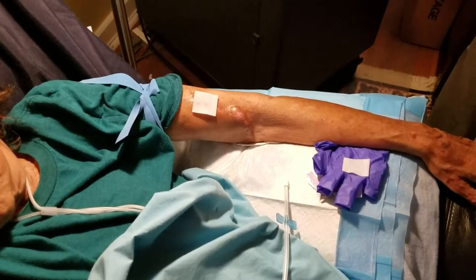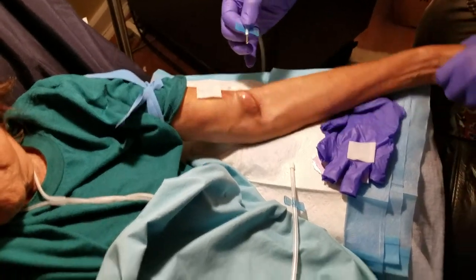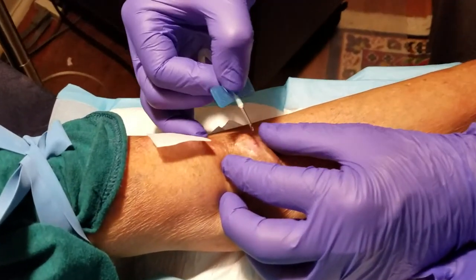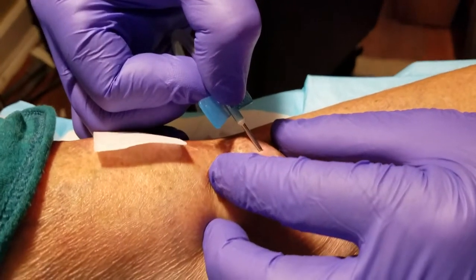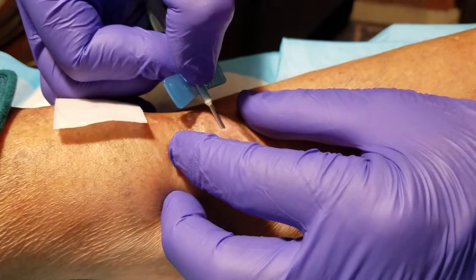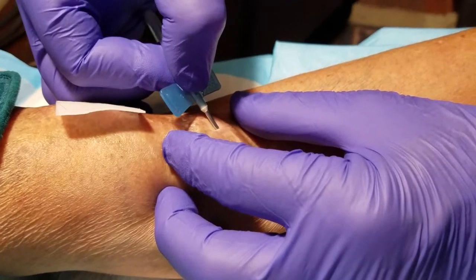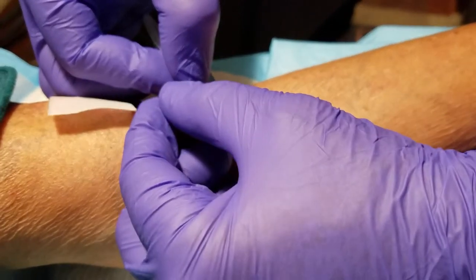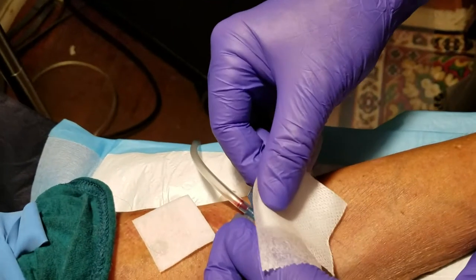All right, so we're gonna put the arterial in first, and I want you to just turn it on. The needle is — there's that little hole right there, and I know the angle. And sometimes it just slides right in. And you can see the flash there, the blood coming up a little bit.